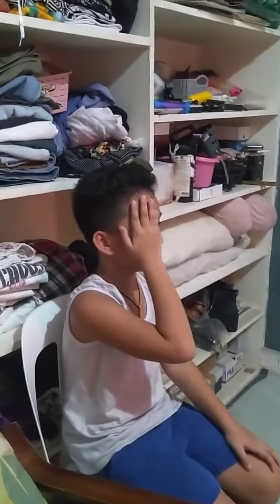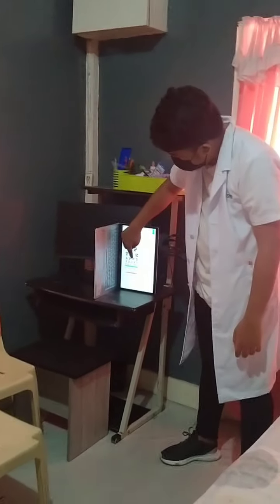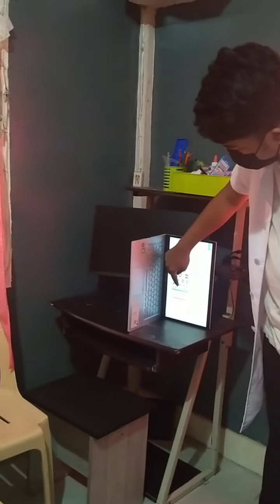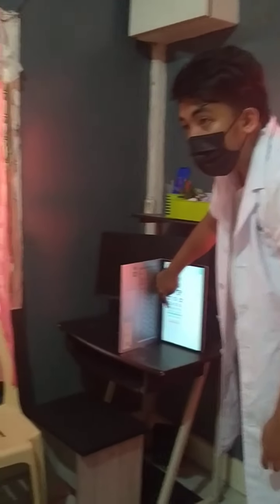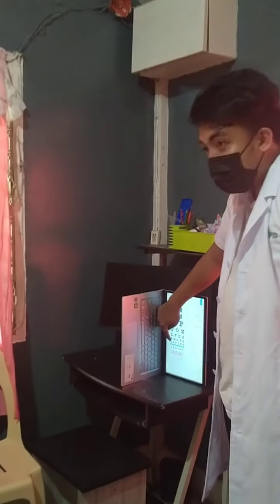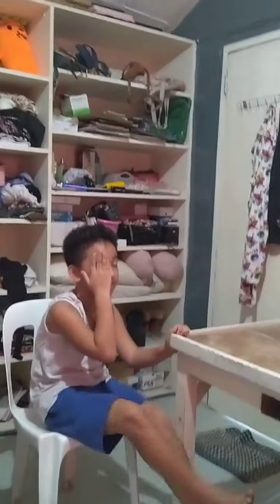This one, sir? E, F, P, G, O, Z, L, P, E, D, P, E, C, D, G, E, D, F, C, Z. I can't see now. You are too far, sir. Let's move a little closer to the Snellen's chart. Let's move closer, sir. Quick, sir. Okay, let's move forward, sir. Yes. Cover it, sir.